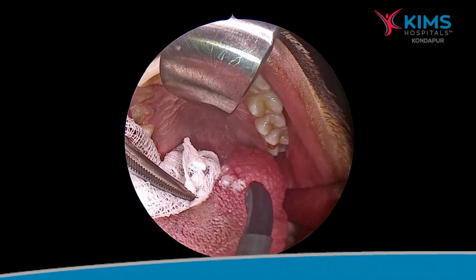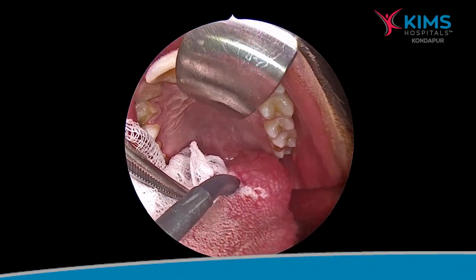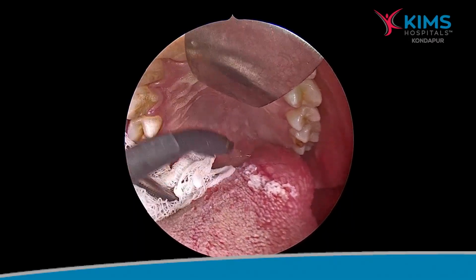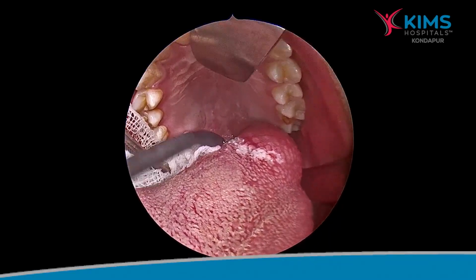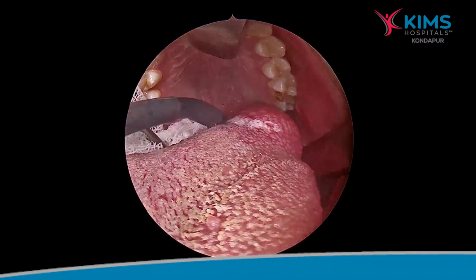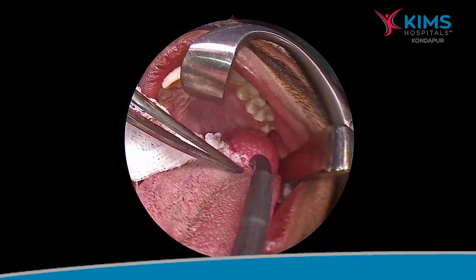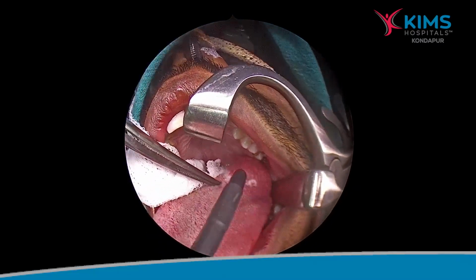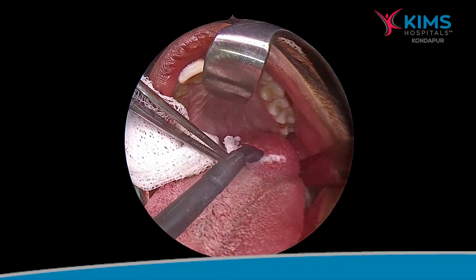At the anterior border of the tongue, first we used a Coblator wand to cauterize the tissue surrounding the tumor. The idea is that initially we cauterize using the coagulation mode, and for the incision we take a radiofrequency needle or probe.